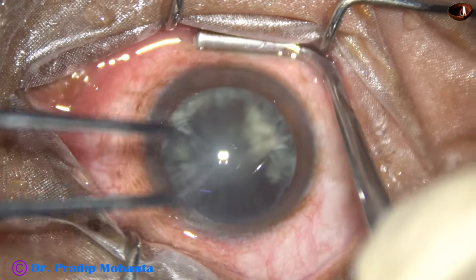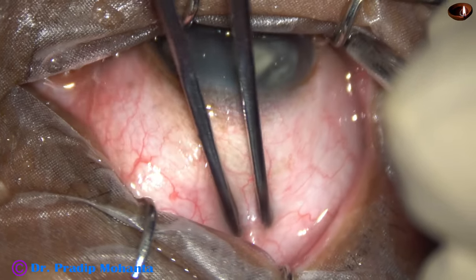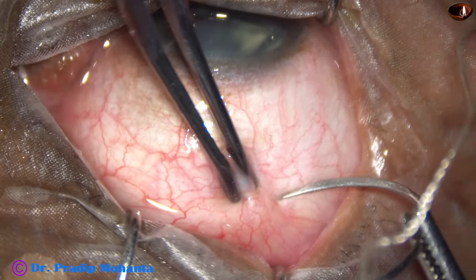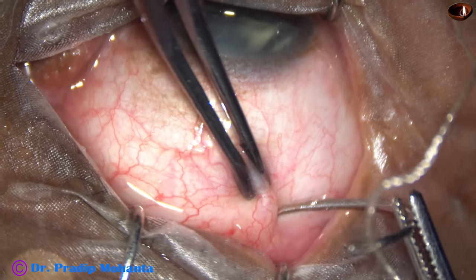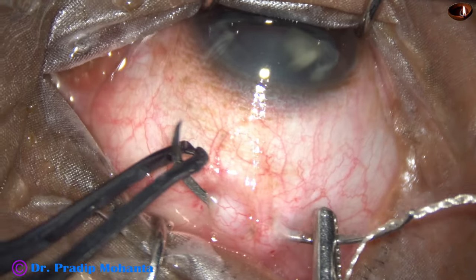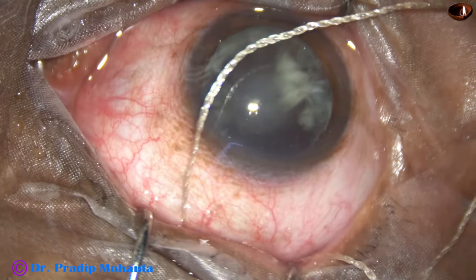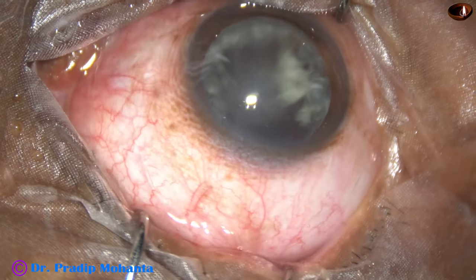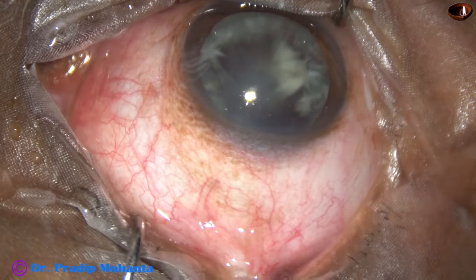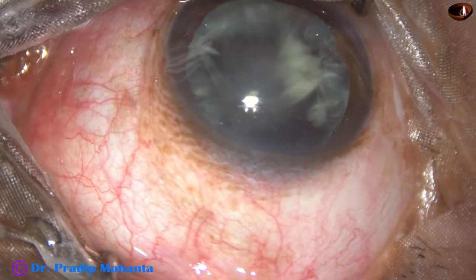First, how to hold the superior rectus tendon. Use a muscle hook to push the eyeball down. Use a superior rectus holding forceps and pass the superior rectus bridal suture underneath the superior rectus tendon. Use another forceps to pull it out and now this suture is pulled. It makes the eyeball stable and making the tunnel becomes easy.